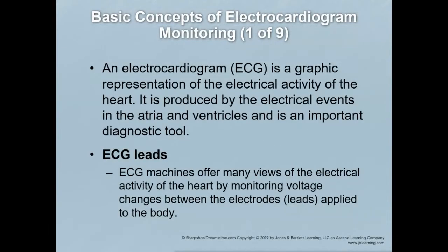This is going to be the section on ECG monitoring for paramedic cardiology. We often refer to electrocardiogram as an ECG. Some people refer to it as an EKG. All those terms are interchangeable. But basically what we're doing is we're obtaining a graphic representation of electrical activity in the heart.